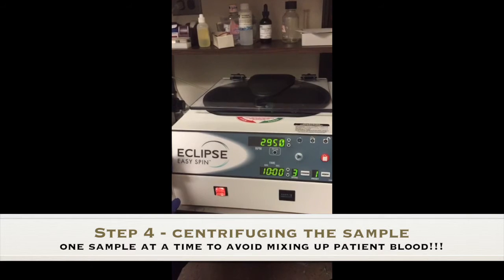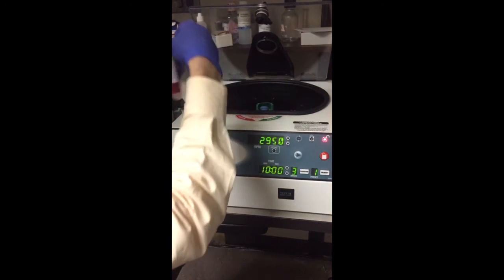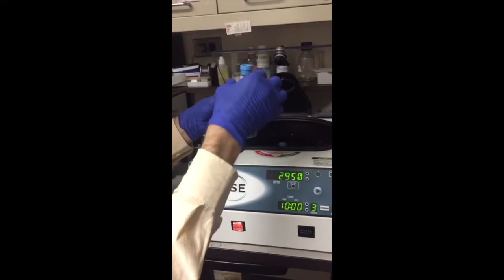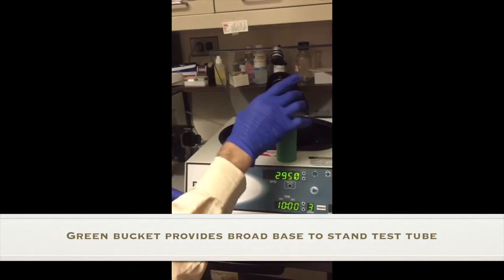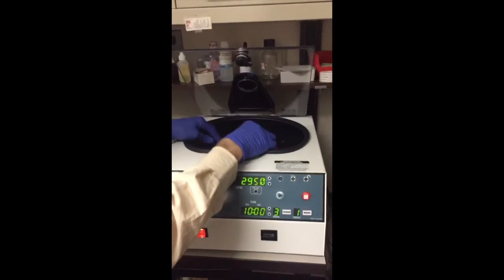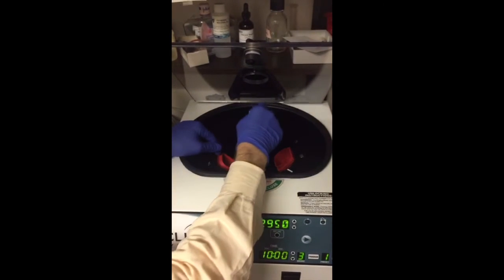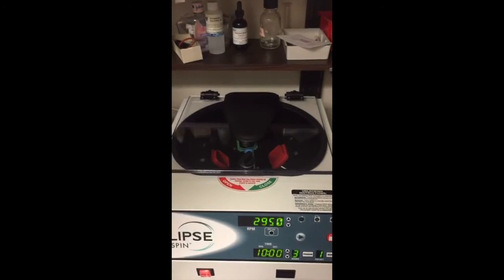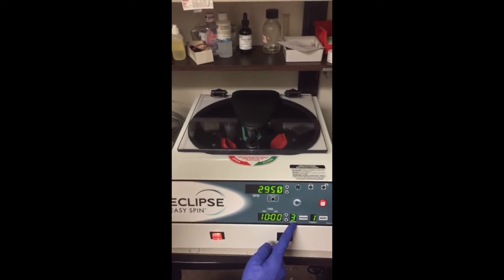We turn the power on the centrifuge and press the button to open it. You put the specimen tube opposite the balancing tube — they have four holes. You close it and lock it. This is already preset to 2950 RPMs, set for 10 minutes with a brake of three.